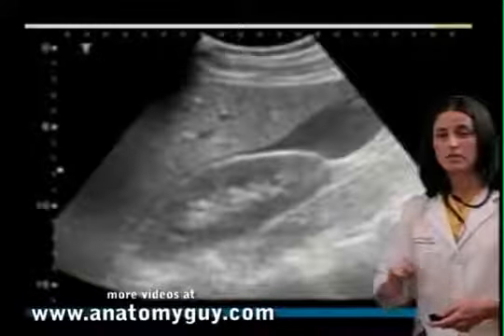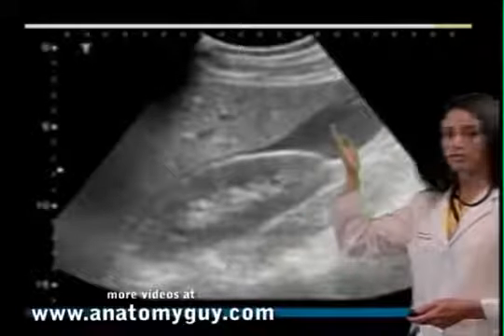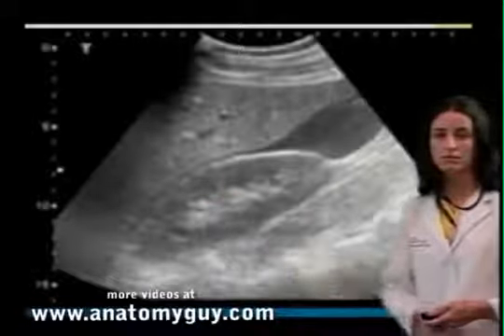With the FAST exam, you need to make sure that you include the entire liver tip, because sometimes there can be fluid only in this region here, but not fluid further along the stripe between the kidney and the liver.